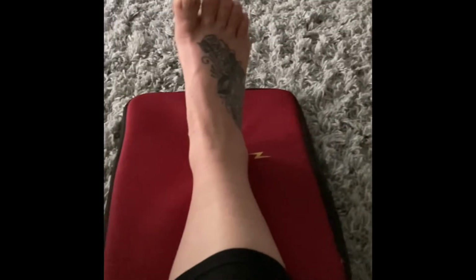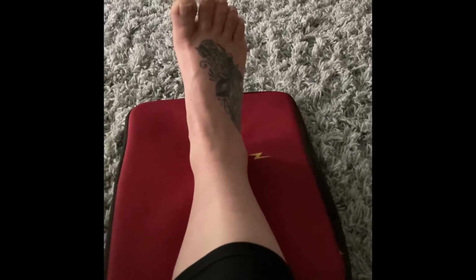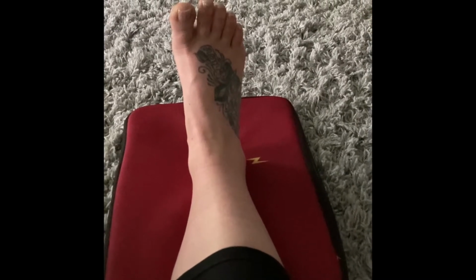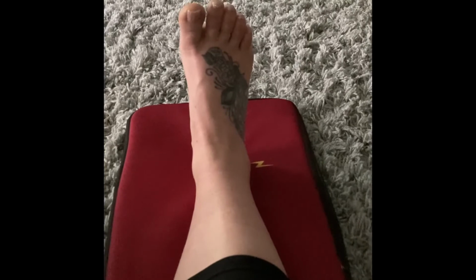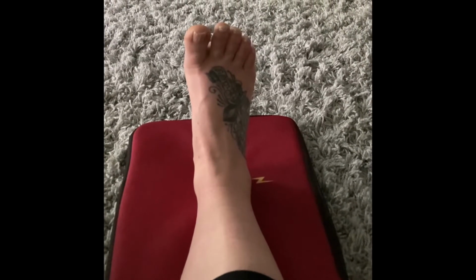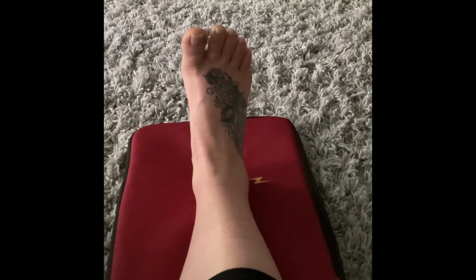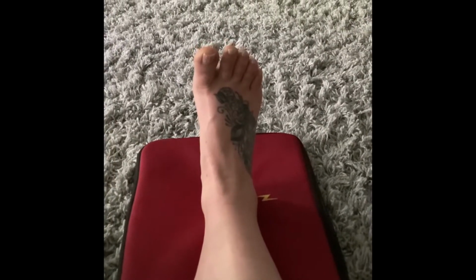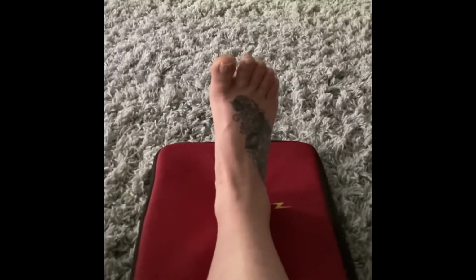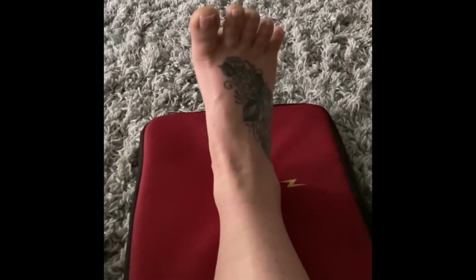Okay, so this week we're doing the ankle and calcaneus views, or the heel views. So for AP, for the mortise joint, for all the views, first of all, we are going to be using 40 SID. We're going to be collimating to the smallest portion that we can, make sure we see all the structures.